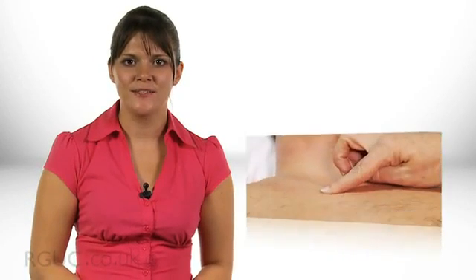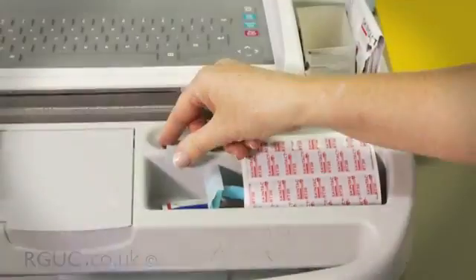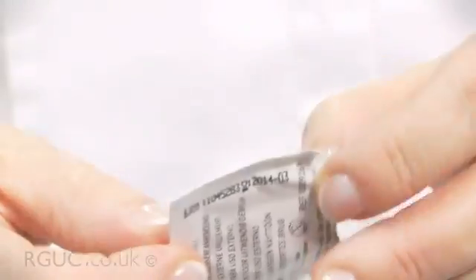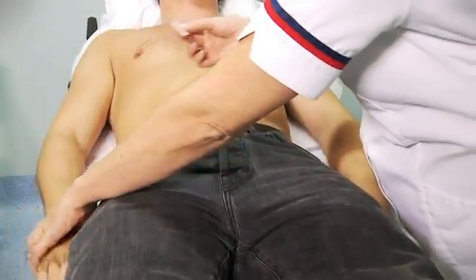You are now ready to begin the procedure. Identify the site of attachments for the electrodes accurately and at these sites prepare the skin. This is required to ensure good contact and therefore produce an artefact-free and accurate ECG trace. If required, use a razor to remove hair, then dispose of the razor in a sharps bin. Using the abrasive preparation pad, lightly exfoliate the skin surface. Using the alcohol-based cleansing wipe, clean the skin over the exfoliated sites and dispose of the wipe in a clinical waste bin.